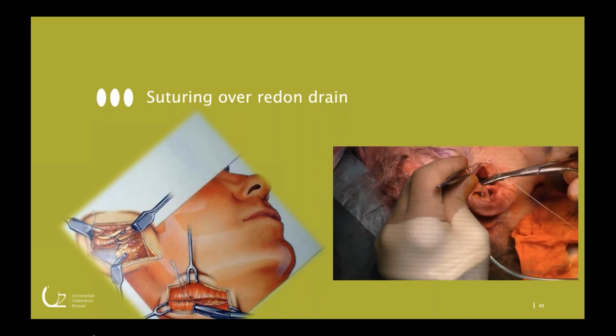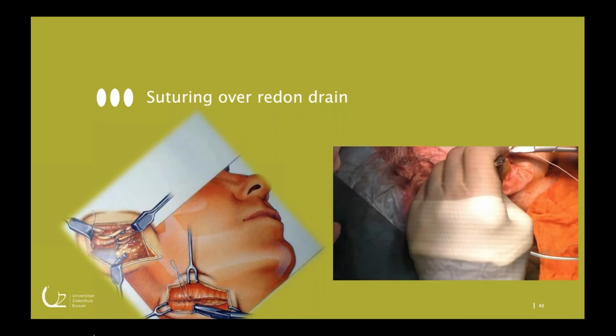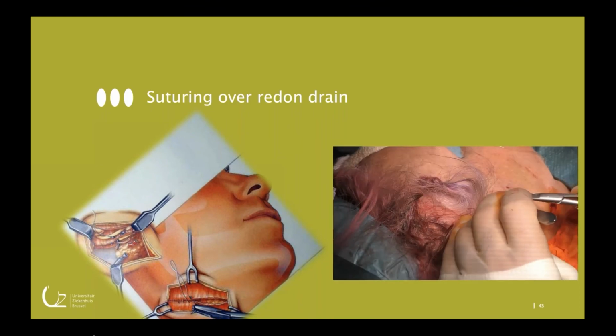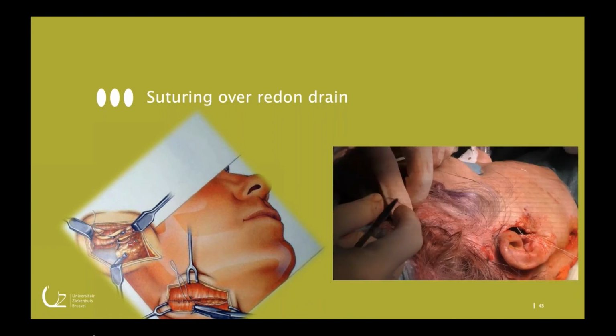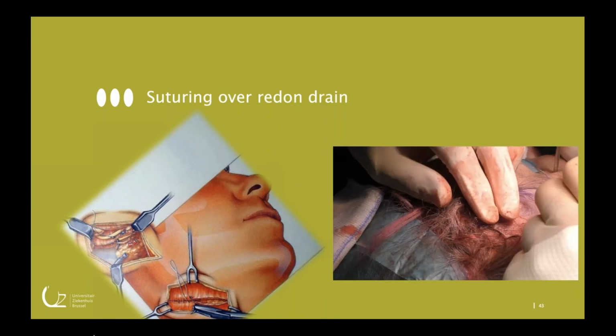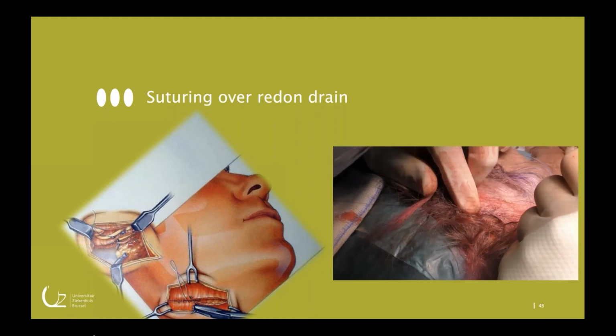So this is very simple, step by step explained, the procedure. There are a lot of details and intricacies for which you may approach me later on by email, for example, or in the question box. But this is to show you that there is no magic about total joint replacement. The whole thing is to work in a very sterile way.